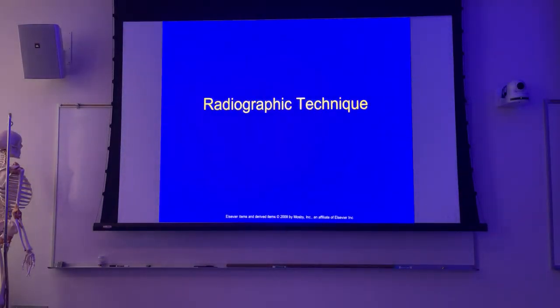We're not going to talk quite as much about image acquisition as we are about the X-ray beam as it interacts inside of the patient, picks up the signal, is emitted from the patient, and strikes the image receptor. Certainly, we'll talk some about the computer processing, but the title of the chapter seems like that's the majority of the focus, and it is not. It's manipulation of the image so that we control the quantity and quality of X-rays as they come out of the patient and interact on the image receptor, and how that affects the image, essentially.